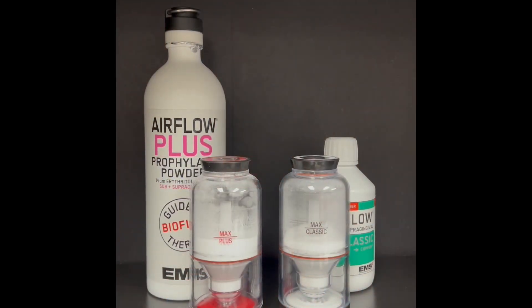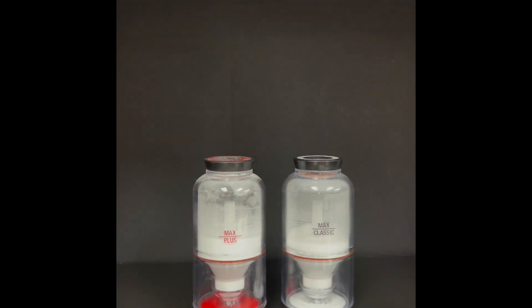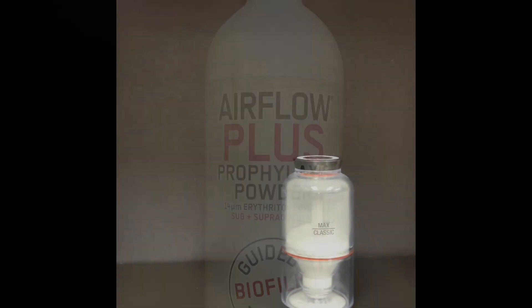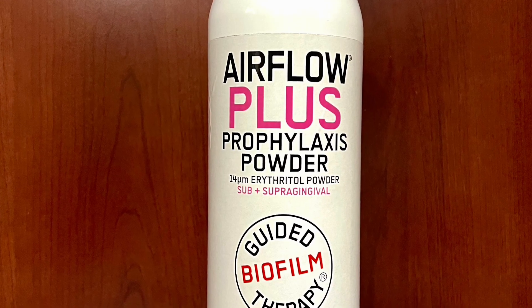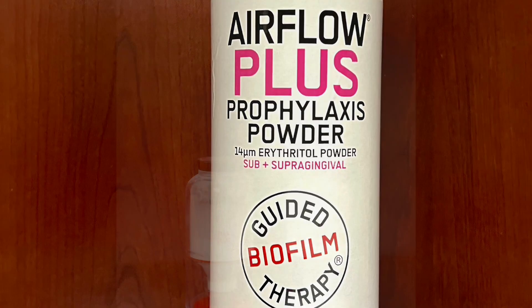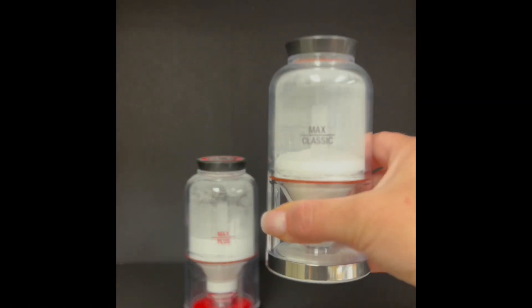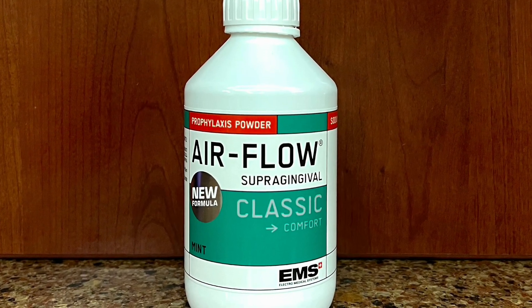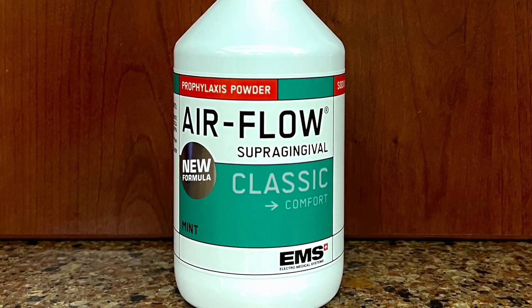Two different powders are available for the air polisher. Airflow Plus Powder is comprised of erythritol and chlorhexidine, and is designed for all uses of the Airflow air polisher. Airflow Classic Powder is comprised of sodium bicarbonate and is only used for supragingival applications, but works well on heavy stain.